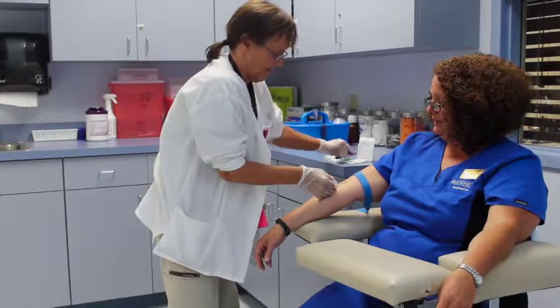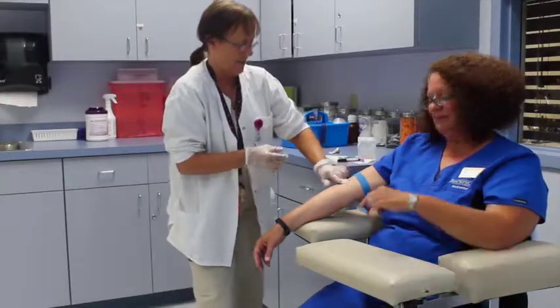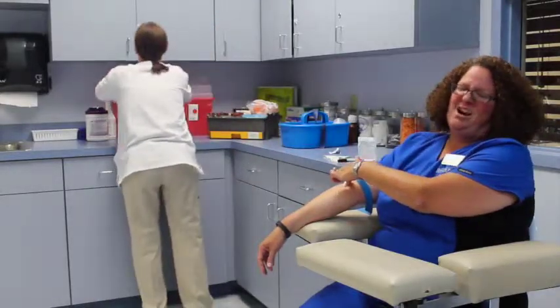Then you'll remove the tube very gently. You don't press down on the gauze until after the needle is done. Always ask your patients to help.